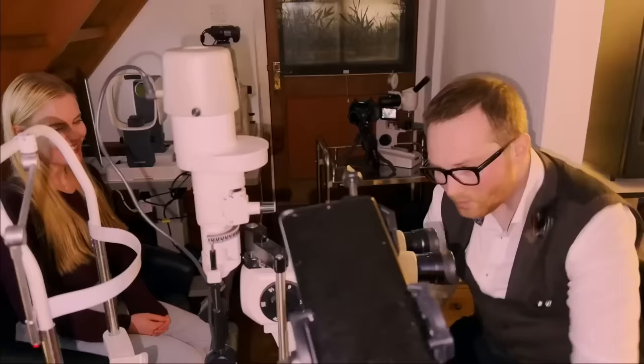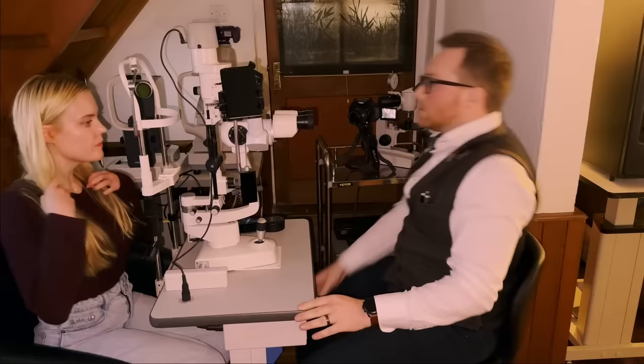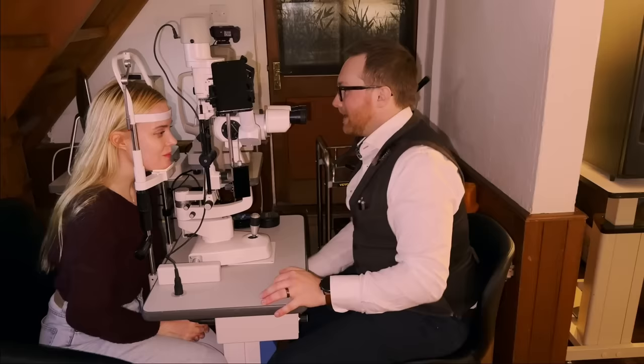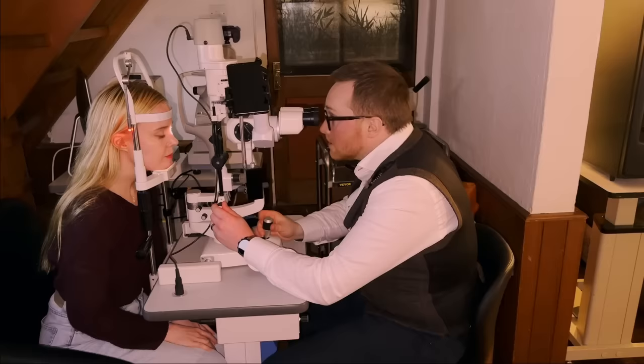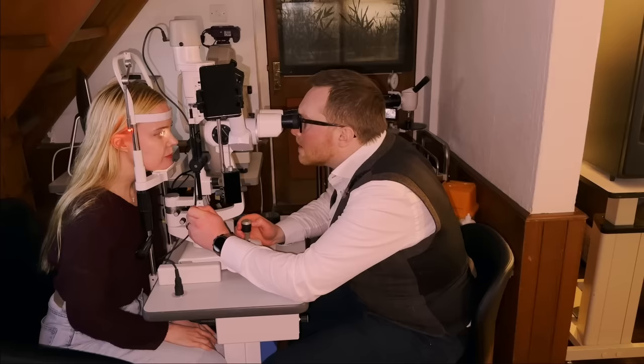Okay. Right, so let me just bring this around. And I want you to pop your chin on the chin rest there for me. There we go. Now, is that comfortable there for you? Perfect. If it gets a bit uncomfortable, let me know. Now, blink as often as you need to with this one. And let's just look. So I'm going to get you to just look straight ahead to start off with for me. Good. Let me know if it gets a bit bright for you as well.